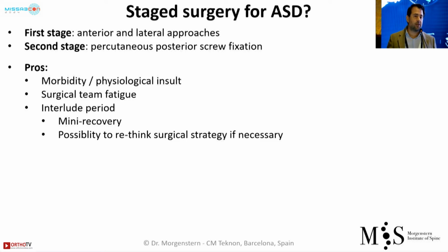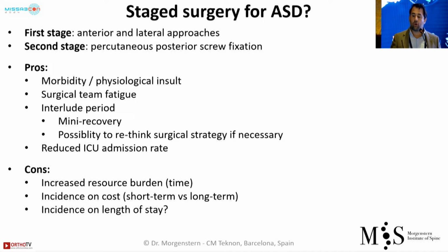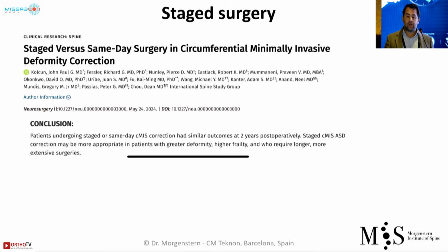And you have the possibility to rethink your strategy. This is actually a very important thing, because sometimes you do your correction and afterwards you change your plan. Of course, this will take you more time. It will imply more costs, at least short term, and it will eventually have a longer stay or not, depending on how your patient behaves.